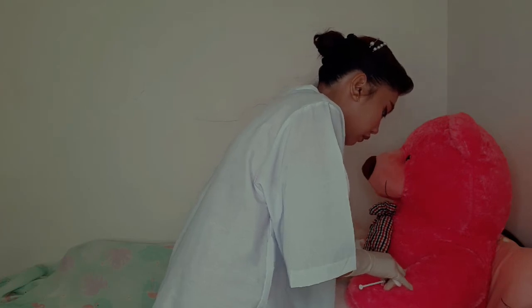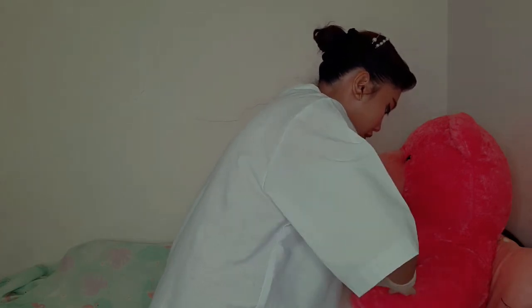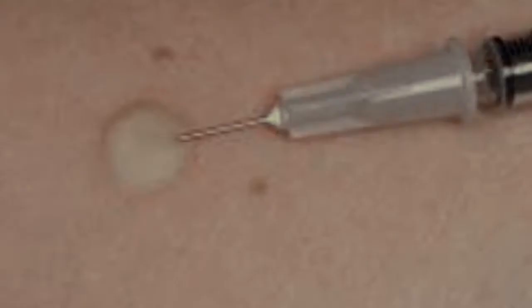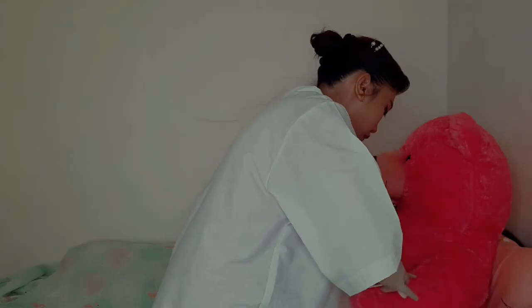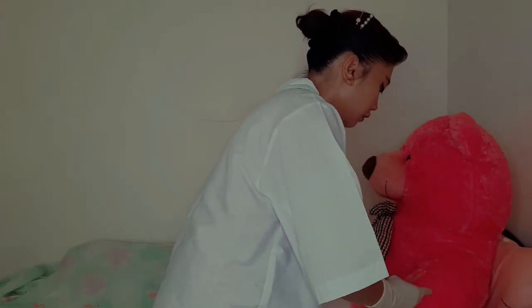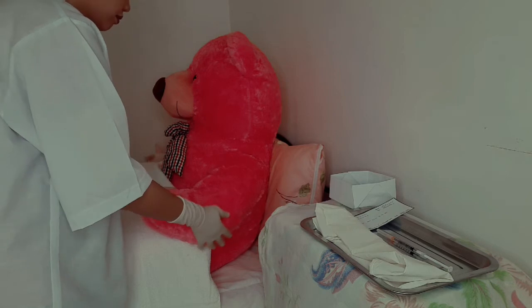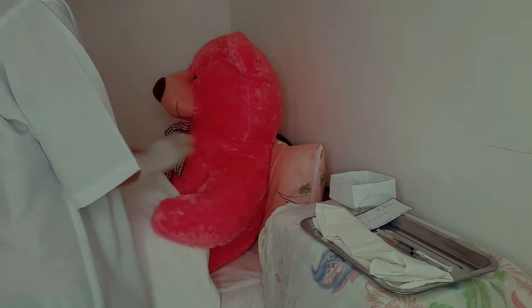Hold the syringe and place the needle with the bevel side up at a 15-degree angle against the skin. Insert the needle point into the skin and introduce the medication slowly and gently to create a bleb or wheal about 1/2 centimeter in diameter, then withdraw the syringe. Do the technique of 1-hand scoop method. Do not press or massage. Instruct the patient to not apply pressure.